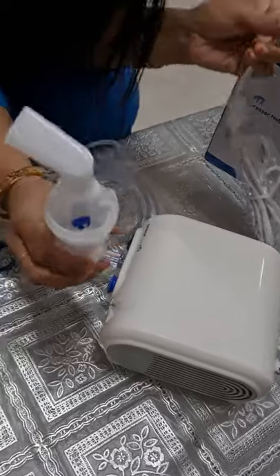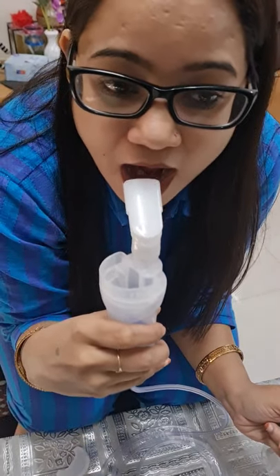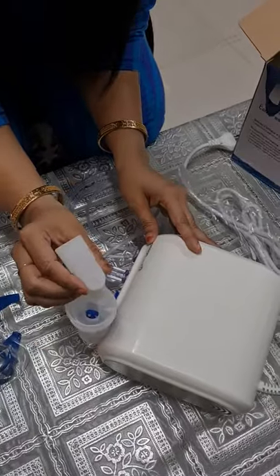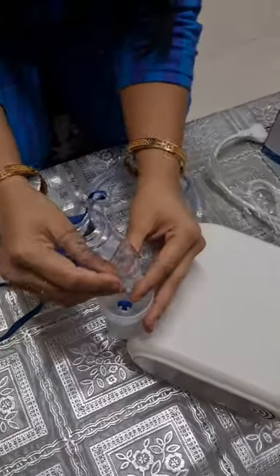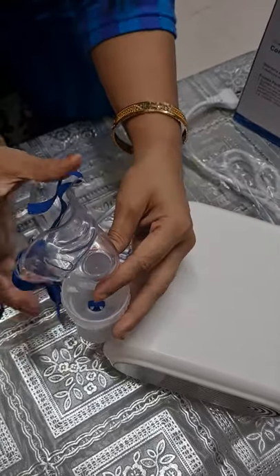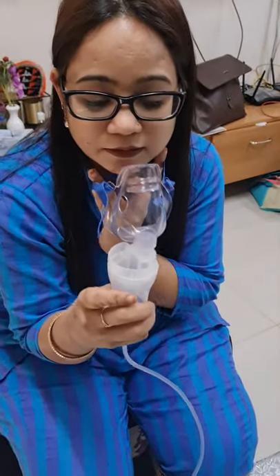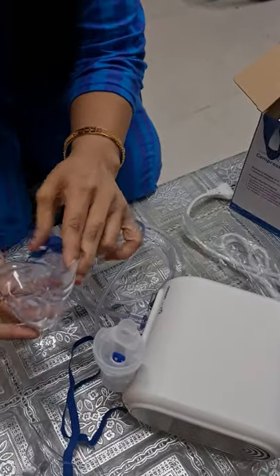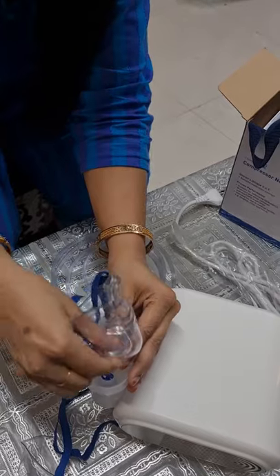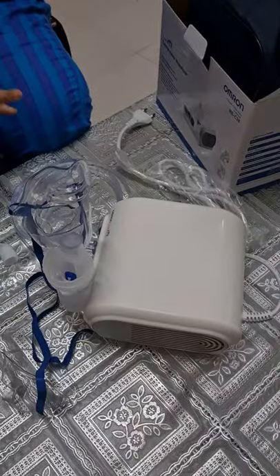If you want to take it from the mouth, just take it in your hand and put it in your mouth like this — this is the mouthpiece. Now if you want to use the mask, this one is for kids. Put the mask like this and fix it over here — you can use it like this, put it on the child's face. And for the adult mask, you can put it like this, fix it and then use it. This way you can do the treatment.